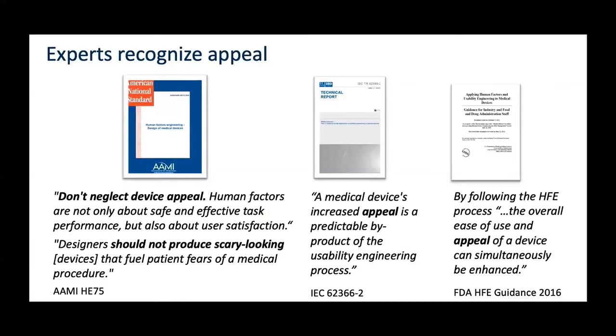And this, Tim, actually draws on the thing that we've just been discussing: even within the standards and the collateral recommendations, the guidances, they highlight this point that human factors isn't only about making it safe and effective, but the elegance and beauty of the interface is what appeals to us emotionally. That's something we live every day as designers and engineers, but it's worth reinforcing here that what we're doing is enhancing the commercial viability of the project we're working on.